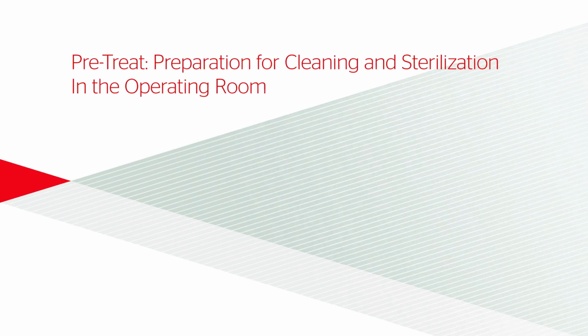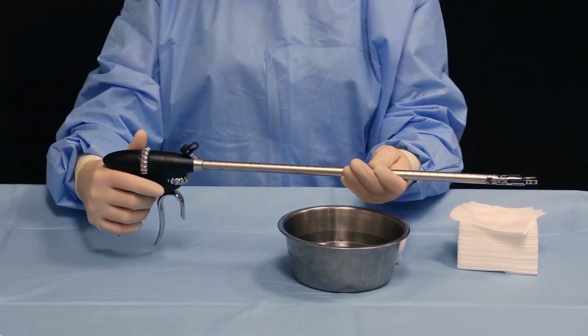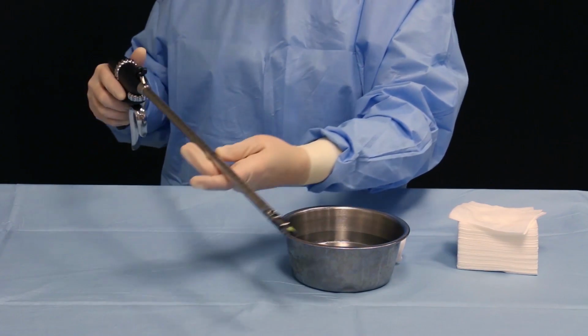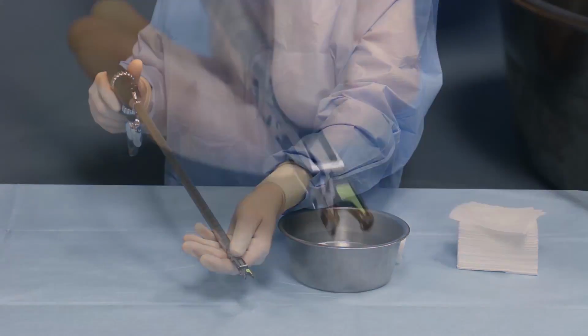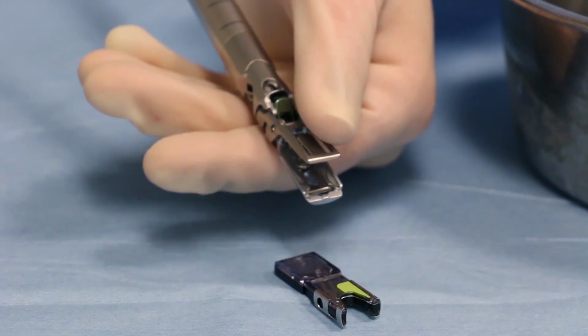Pre-treat. Preparation for cleaning and sterilization in the operating room. Clean the instrument as soon as possible after use to prevent the formation of biofilm and dried-on residue. This step is critical to prepare the device for cleaning and sterilization and will assist with the cleaning process. Ensure the suture cartridge has been removed from the instrument.